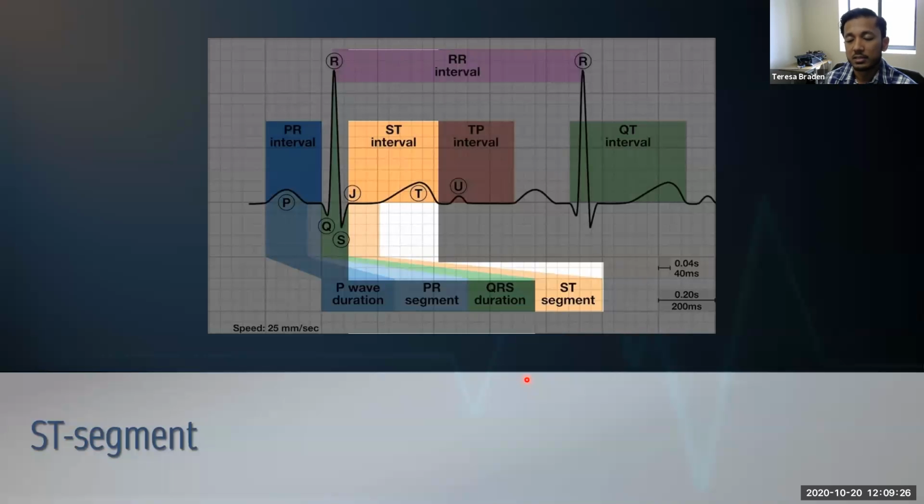So that might be a consistent time where you see it, with PVCs, or if they have atrial fibrillation at baseline. Or if you have someone who has low voltage or even hyperkalemia, where with a combination of low voltage and hyperkalemia, the QRS and the T waves are going to be kind of hard for the computer to distinguish.